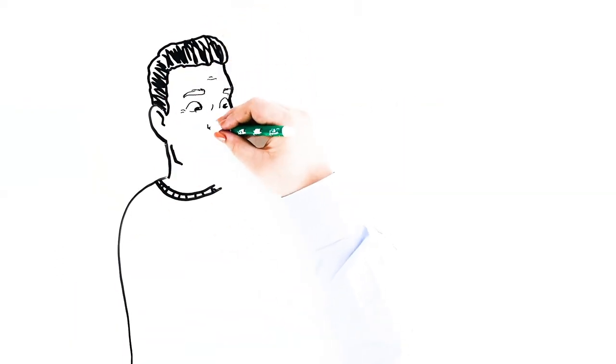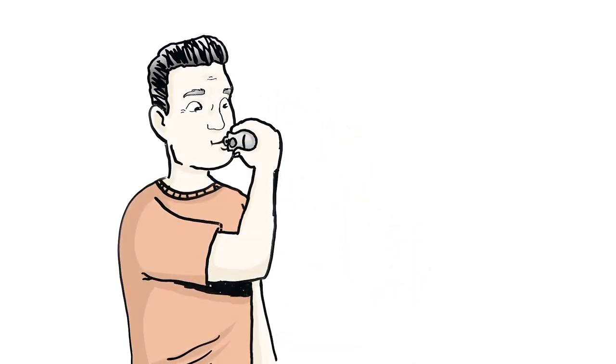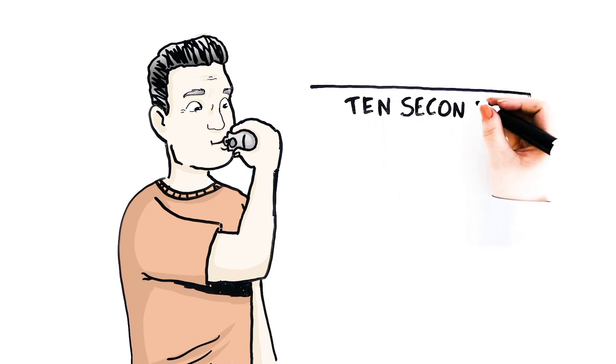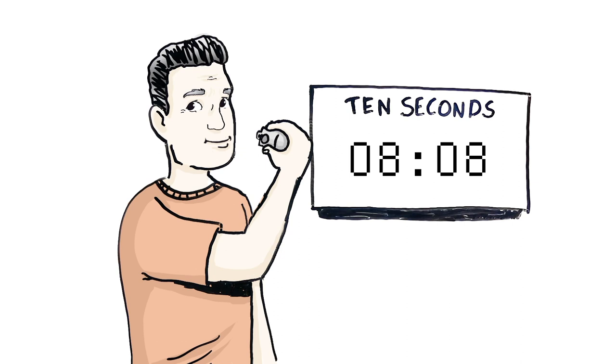Placing his lips around the mouthpiece, being careful not to cover the air vents, he points the inhaler at the back of his throat. While taking a slow, deep breath through his mouth, Henry presses the dose release button. After inhaling his medication, Henry holds his breath for 10 seconds, or for as long as comfortable for him.